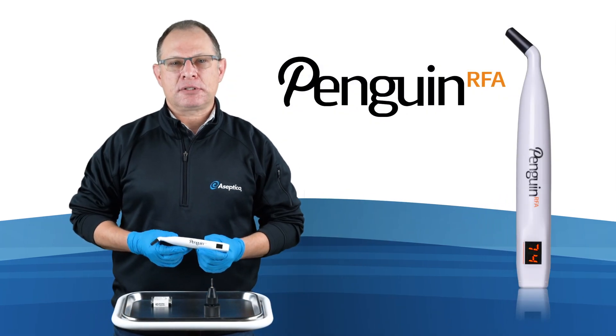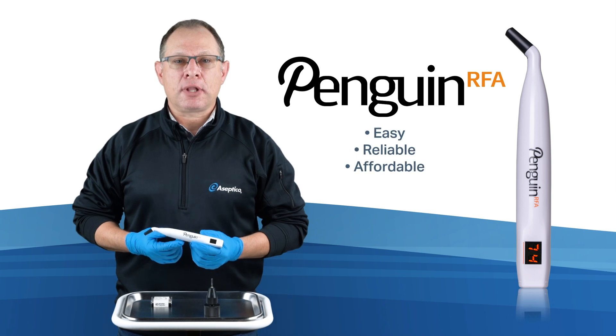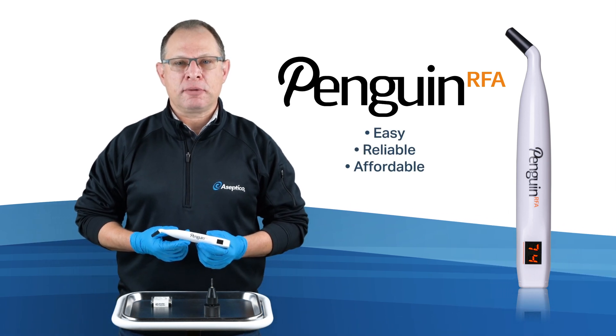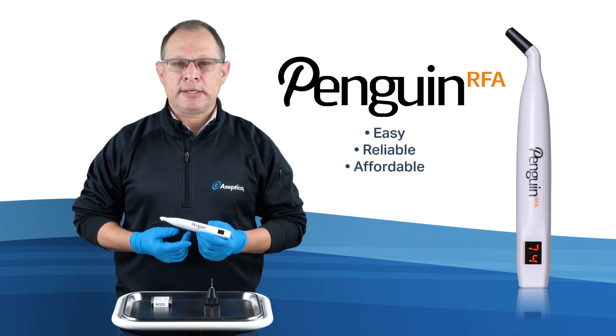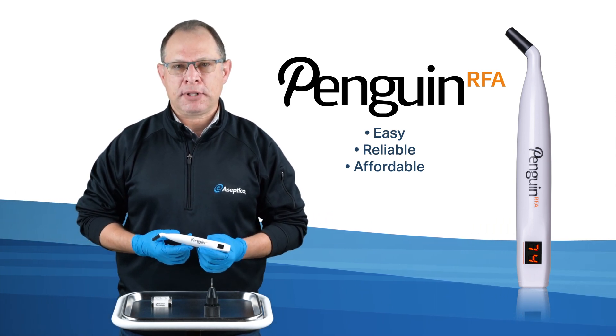The biggest benefits the Penguin RFA provides are that it is an easy, reliable, and affordable way to measure implant stability using scientifically backed methodology to support the clinician's decision of when to restore the implant.